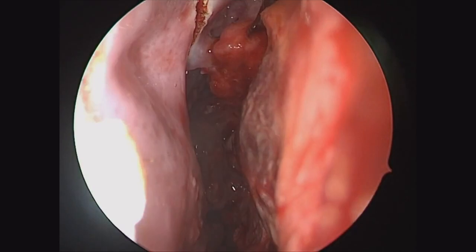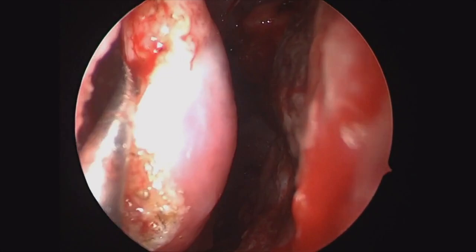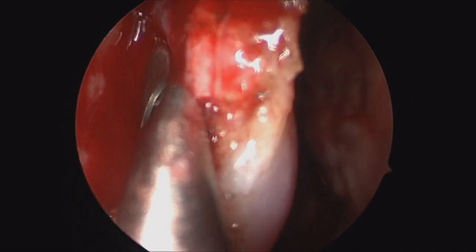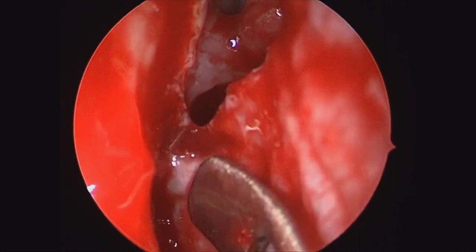We'll begin to raise this off of the lateral wall with a suction elevator. Near the head of the inferior turbinate, this has some relatively tenacious fibers, but can be come through with blunt dissection, getting that proper sub-muco-periosteal plane on the lateral nasal wall, and then transitioning onto the bone of the inferior turbinate as you dissect more inferiorly.